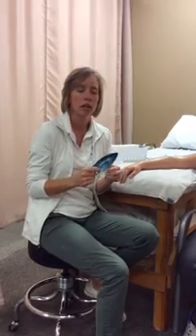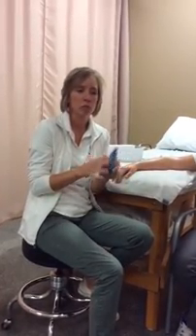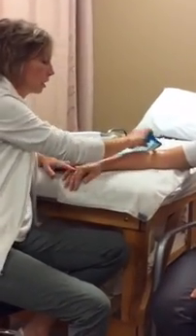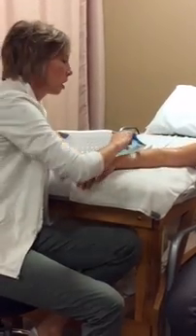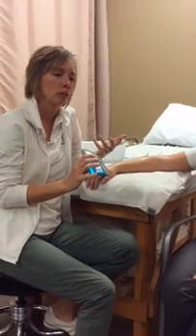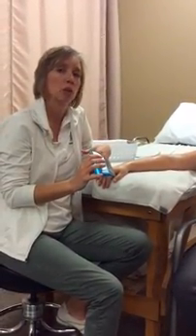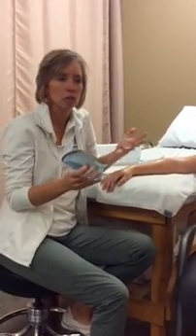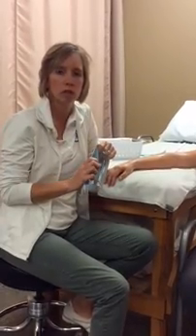So the tools help us find those areas, because when we rub along the skin, we can feel where the smooth areas are, and if we get an area of what we call fibrosis, we can feel that vibration through the tools. So it helps us better assess what's going on and find the problem areas a little bit quicker than maybe we would with doing lots and lots of massage, which doesn't give us as clear of answers as we would get with this.